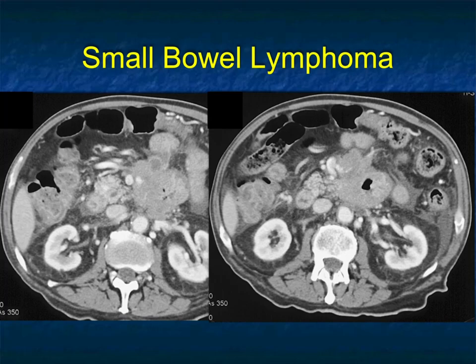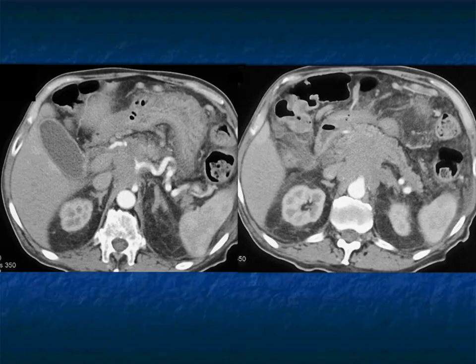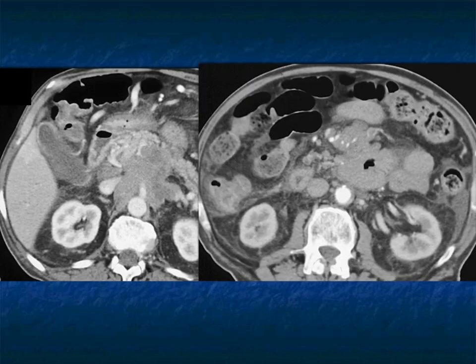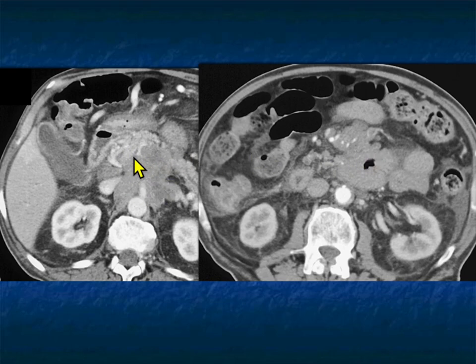Now lymphoma. Here's an example of bulky infiltration of the fourth portion of duodenum and jejunum — there's ulceration, adenopathy in the mesentery, and ascites. The tumor has bulky adenopathy growing posteriorly to encase the celiac axis. You might wonder if it's pancreatic cancer with a tumor of the body involving vessels — a valid thought. But the image showing bowel infiltration gives the diagnosis of small bowel lymphoma, while the bulky adenopathy encasement alone would also put pancreatic cancer in the differential.